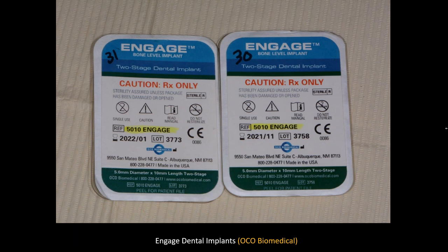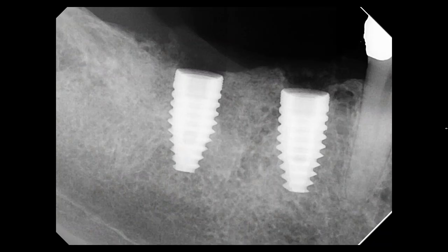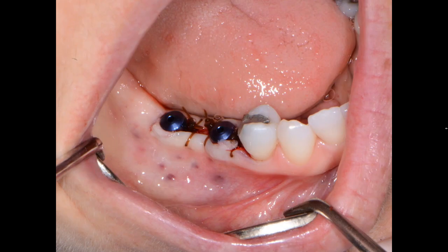We'll place our surgical guide on and go through the appropriate drilling protocol. And then at that point, we'll take our implants. These are the Engage. And you can see we've placed those. We'll take a radiograph to ensure that we're in the ideal position following the guide. And since these are fully seated, we'll place the healing caps and suture this back together.